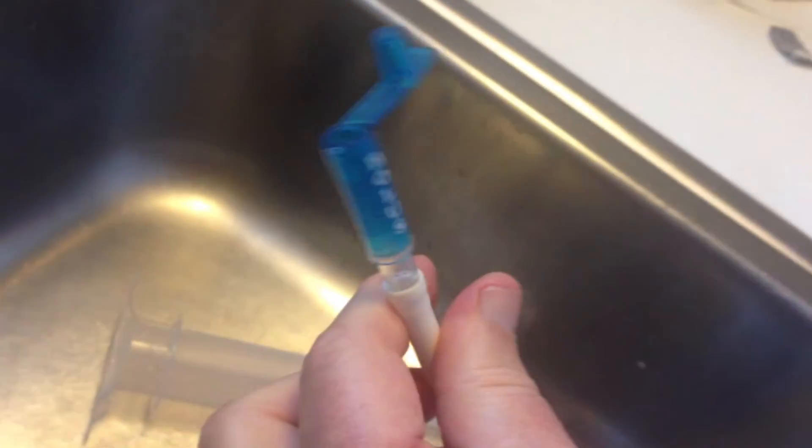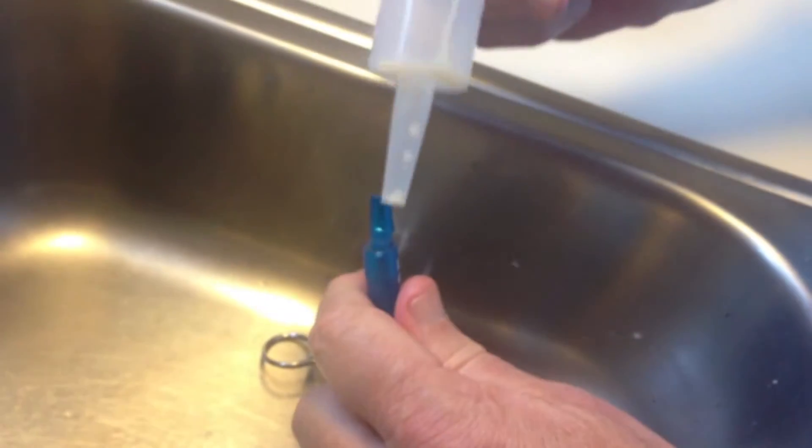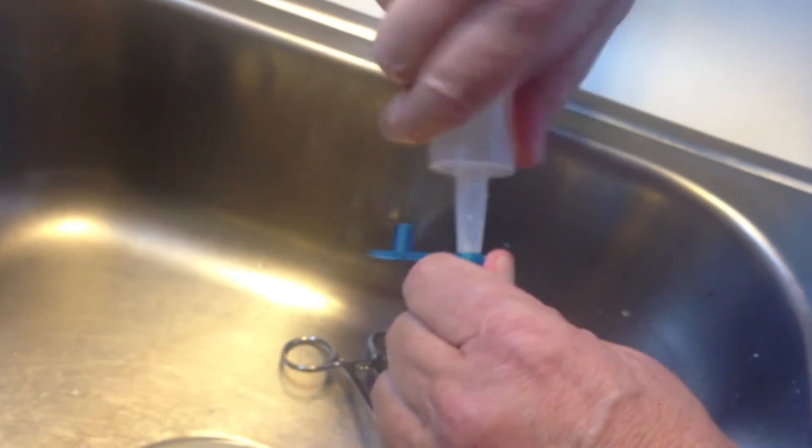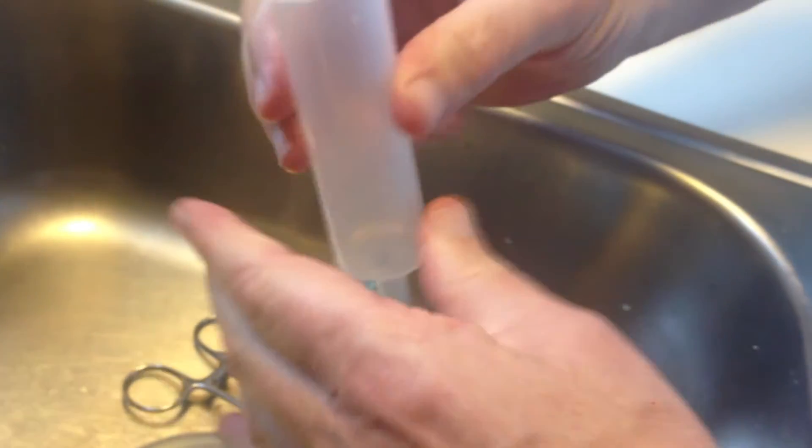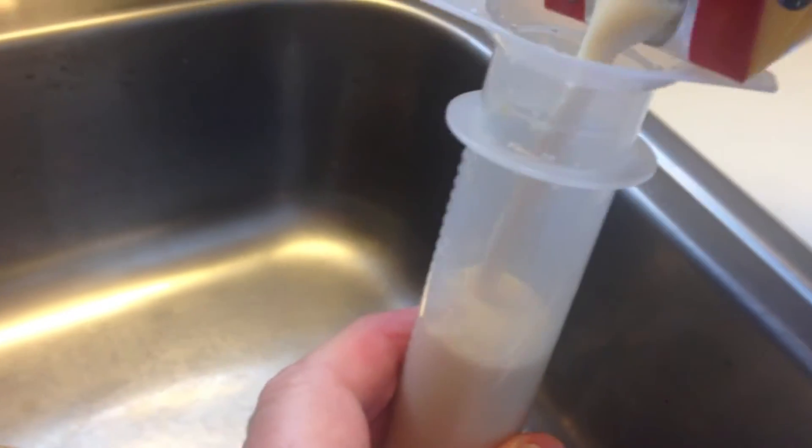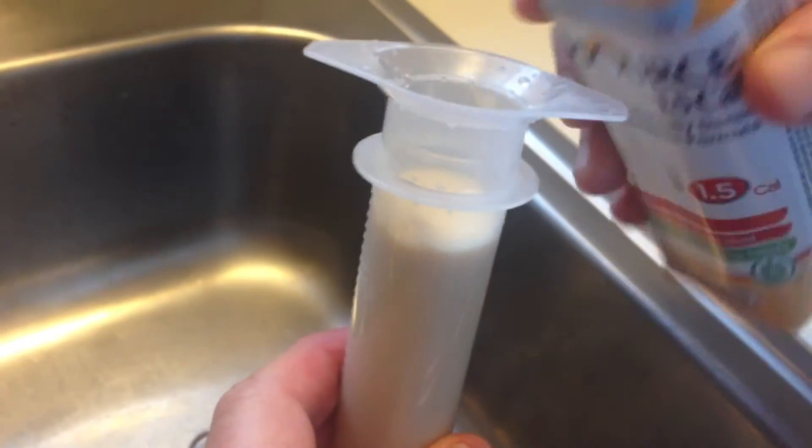Hemostat off the tube, connect it to the standard catheter tip syringe, fill it with 60 cc's of formula.